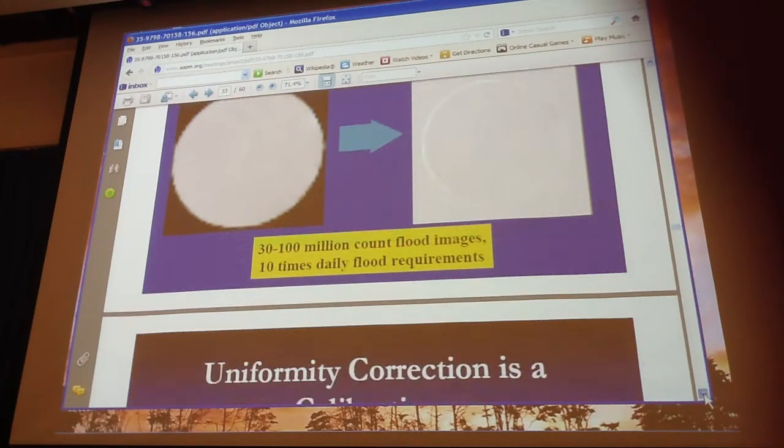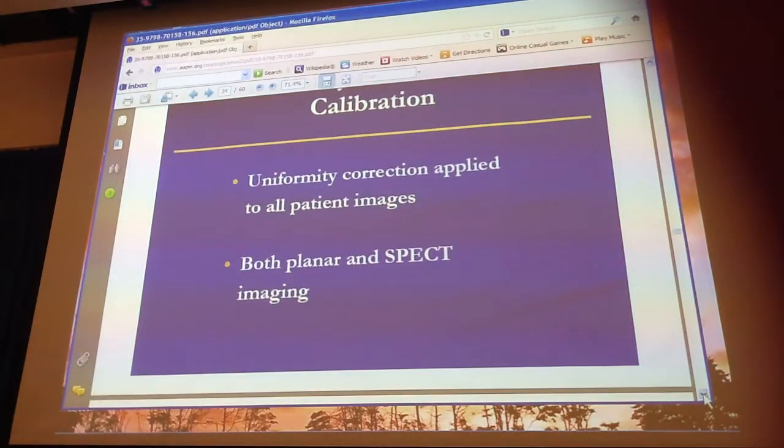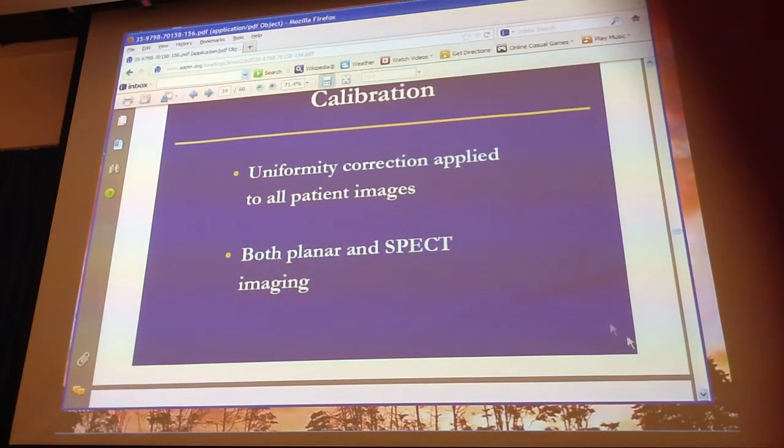But like I said, you normally would be there all day doing that. And again, normally on your gamma camera, you should do uniformity floods also. And I told you that if you do have a camera that you do uniformity correction on, then you need to take a picture with it on and off, so you can actually see what your crystal looks like. Right? That's what Mr. Radke says.